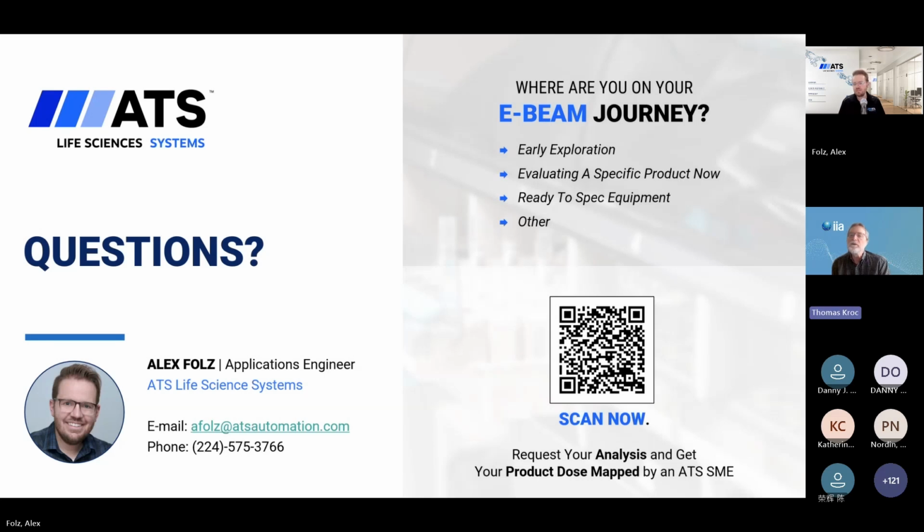Okay, so you mentioned a max DOR of 2. Is this an acceptable limit? That's very product specific. That's what we put out there as a rule of thumb, but it is going to be very product dependent. Even the 25 kilogray is a little bit industry standard, but again, very product and process dependent. So that's typically where we're setting a line in the sand without any additional information from a customer. But if you have known limits, we would love to learn that early on in the quoting phase. Or if you really don't know, we may need to work together to find out what that actual upper end is. At what point do you start to see negative effects to your product? At what point, if you have a UV cure bond or some other aspect of your system, do those start to degrade? So I think we see it as acceptable, but again, very product dependent.